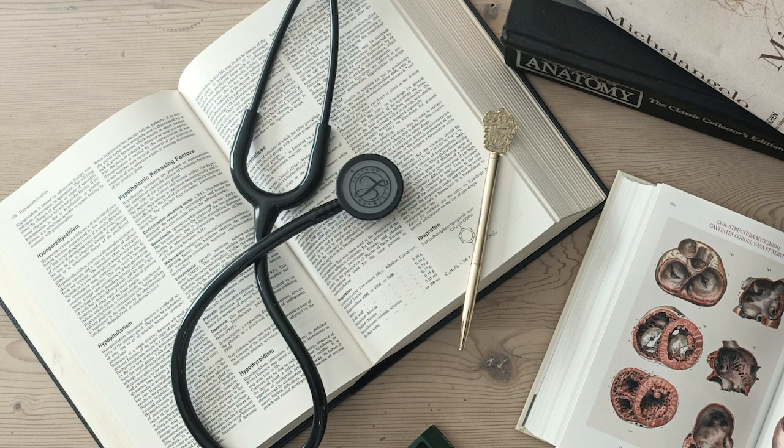VF, this is the one that demands immediate, decisive action, the ultimate electrical chaos. Ventricular fibrillation is unmistakable and truly a lethal change requiring immediate action. It is the most common rhythm found in adult cardiac arrest cases initially. On the ECG, there are no P waves. Instead, you'll see very large, extremely irregular, chaotic waves. The complexes are uncoordinated, constantly changing in shape and amplitude.